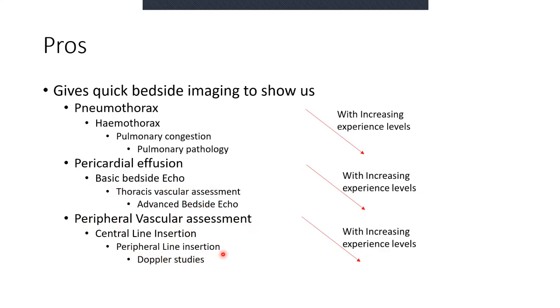And as we go through, every week you will get just a little bit more advanced. But I'll say it again, and I'll say it 100 times. The only way to actually figure out what's going on is to take that probe and put it on that patient. You can watch these lectures 1,000 times. Until you physically put the probe on the patient, you're never going to know what's happening.